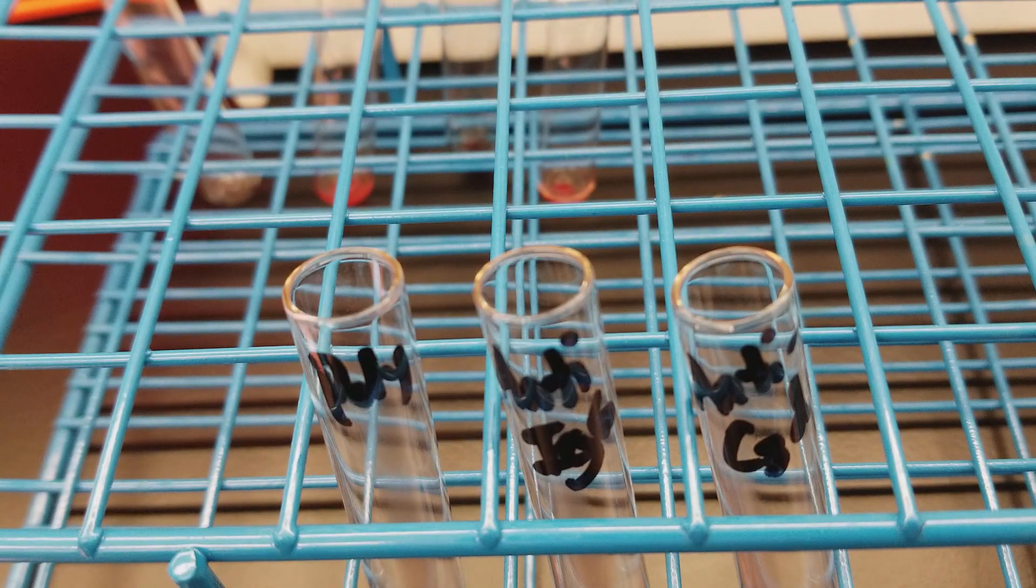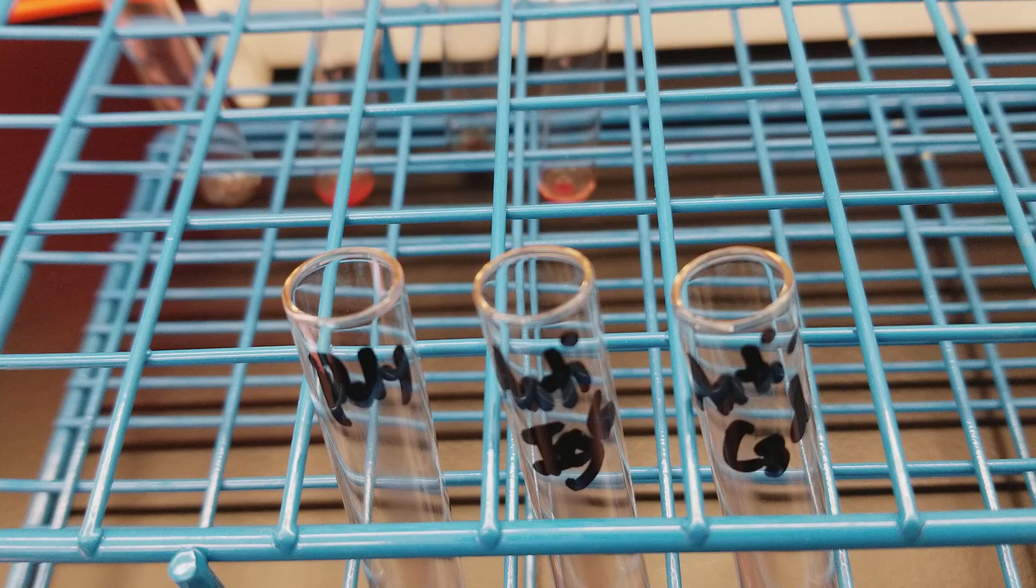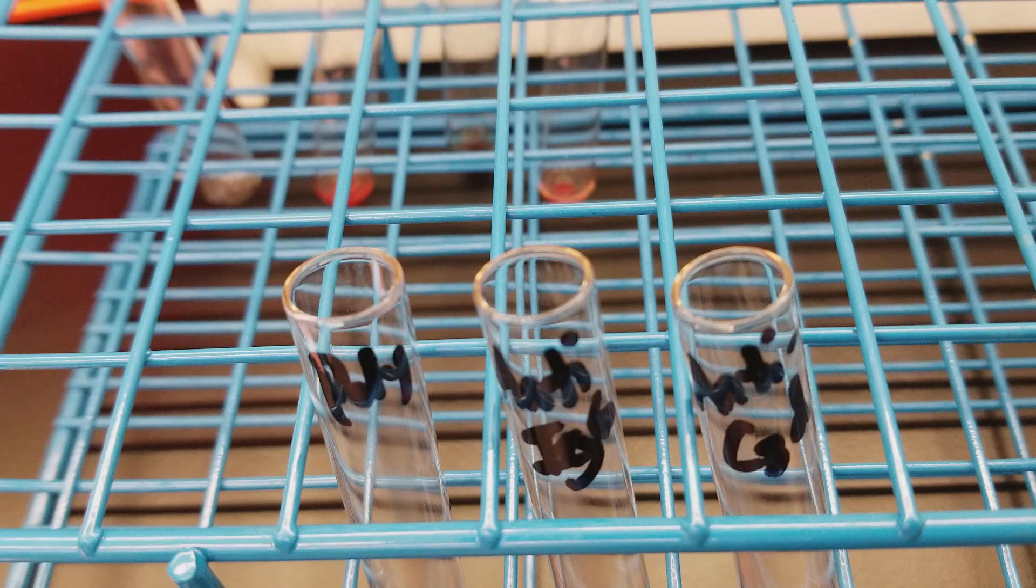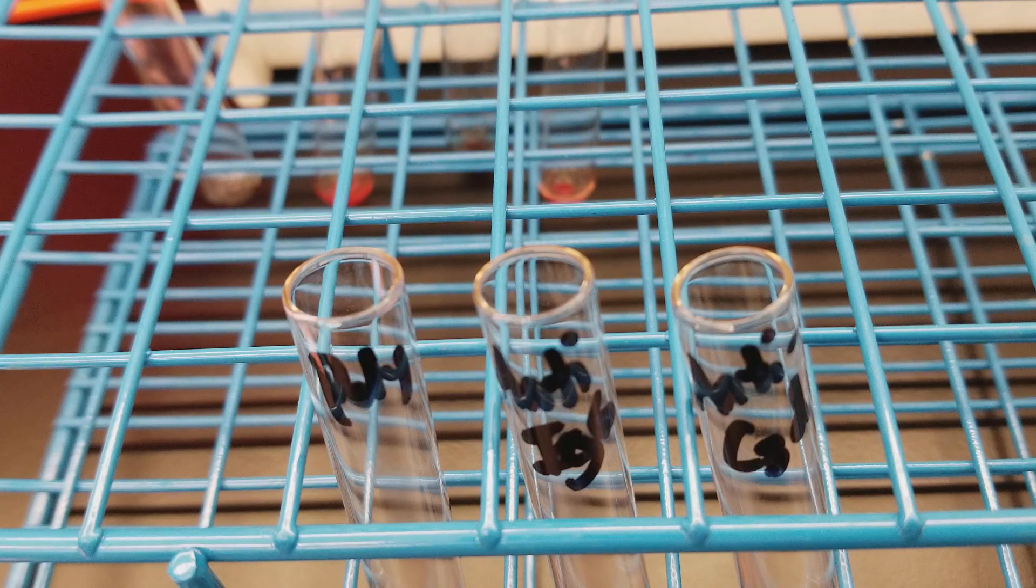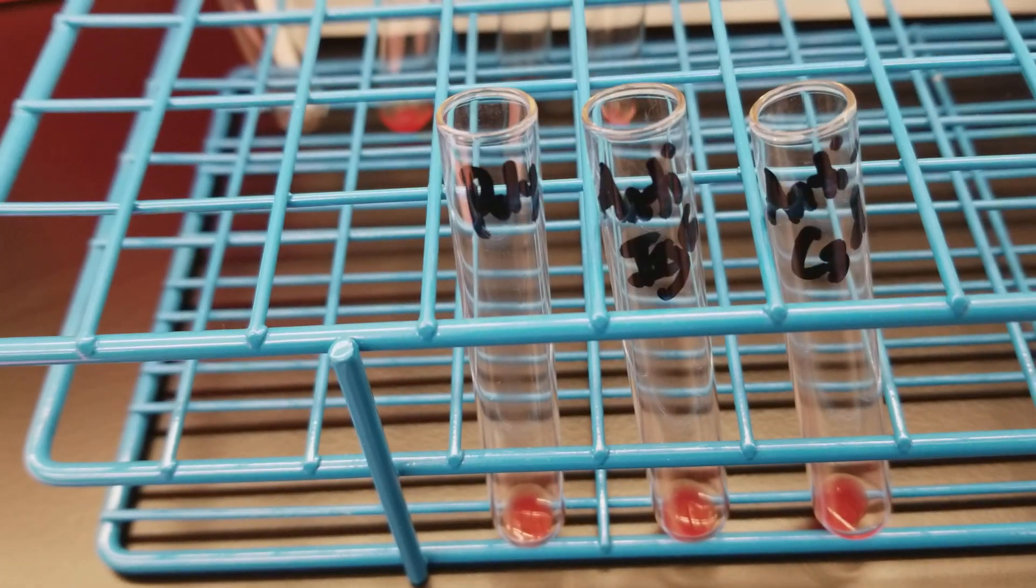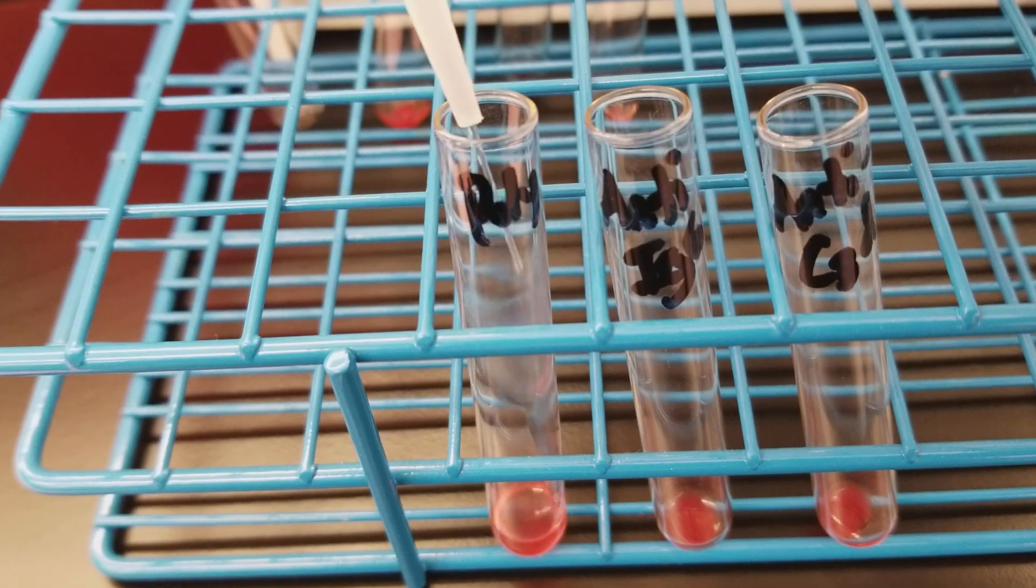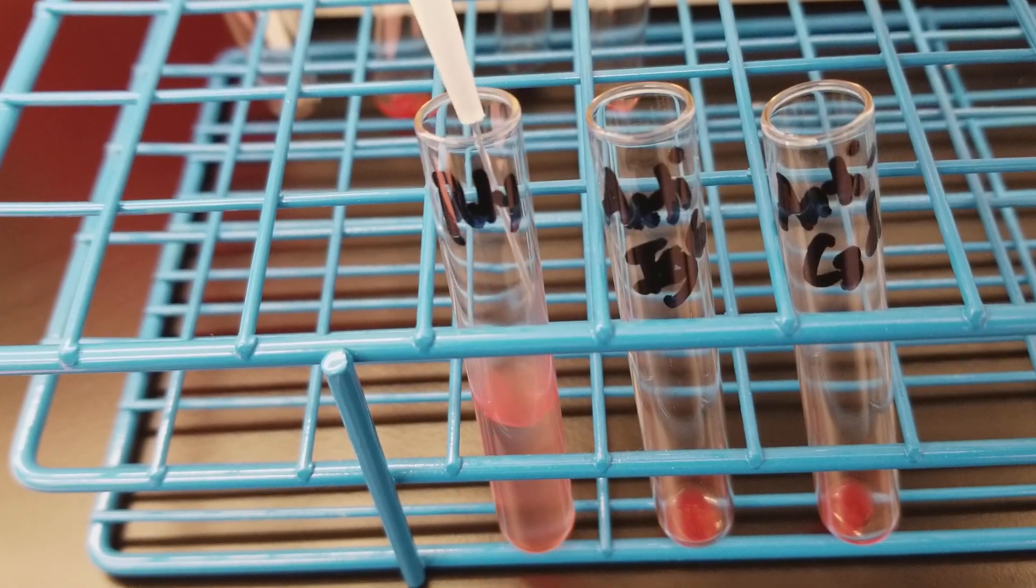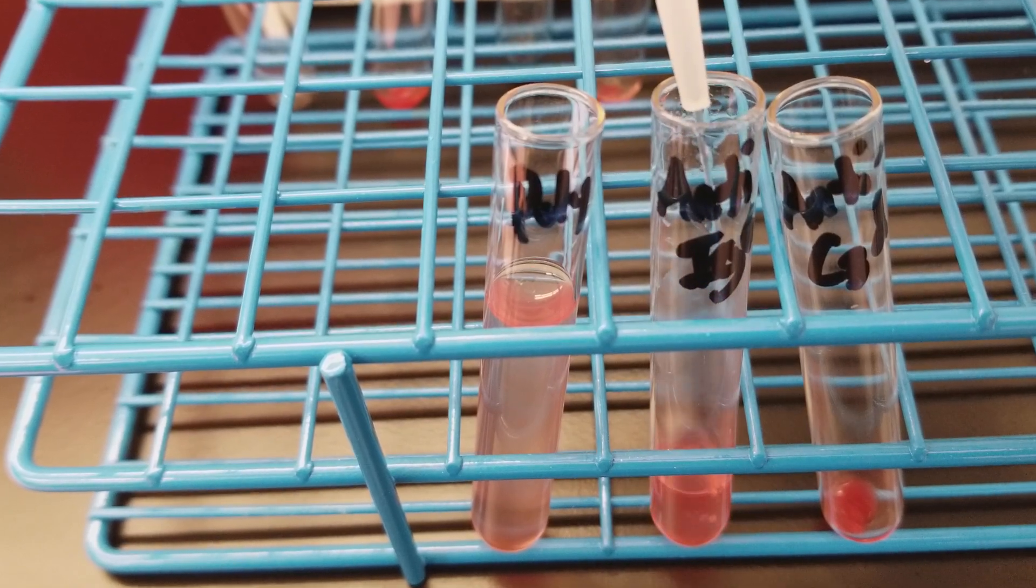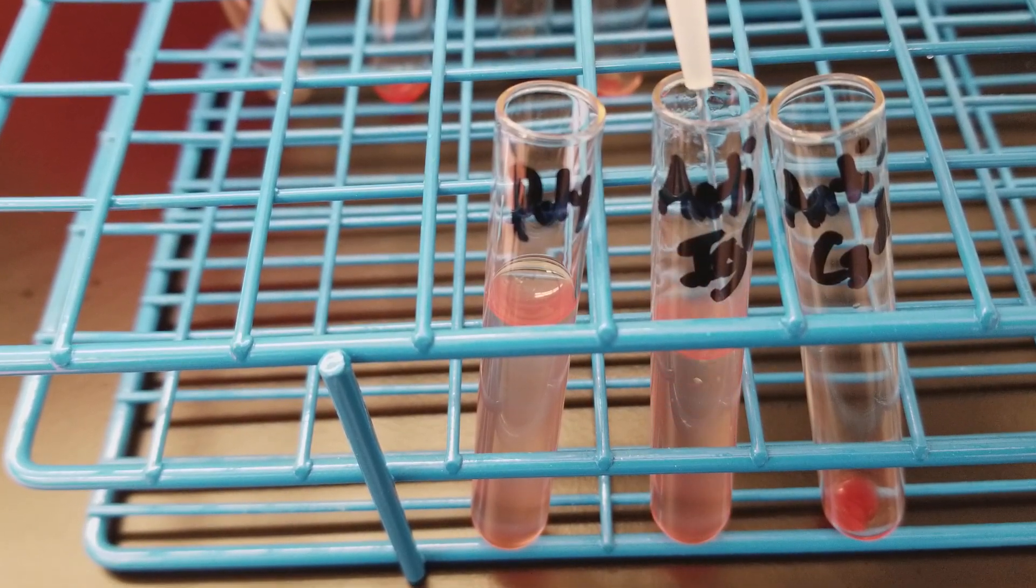Now what I'm going to do is wash those cells three times and then continue on with the actual test. I'm adding my normal saline three quarters of the way up the tubes.